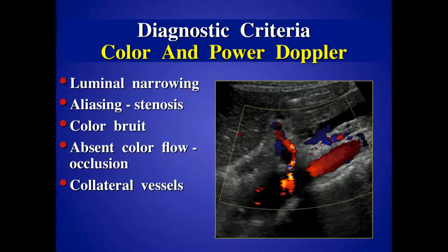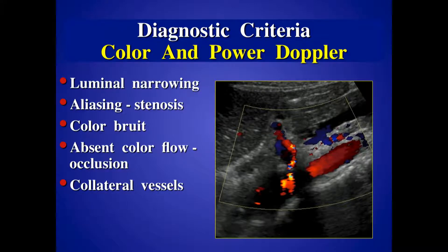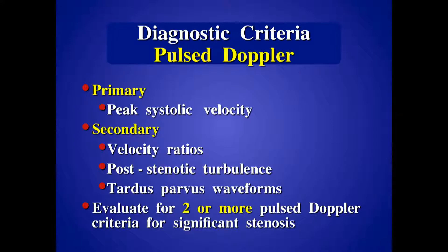Turn the color on, and in this case you can see there's stenosis in the celiac artery — there's narrowing, there's aliasing. With a high-grade stenosis you'll see a color bruit artifact, and it allows you to be fairly certain you have an abnormality — usually a flow-reducing lesion. If it's occluded, optimize it, look for the absence of flow, and look for collateral vessels, which confirms there's a problem. When you see the collaterals and no flow in the main vessel, clearly that means it's occluded.